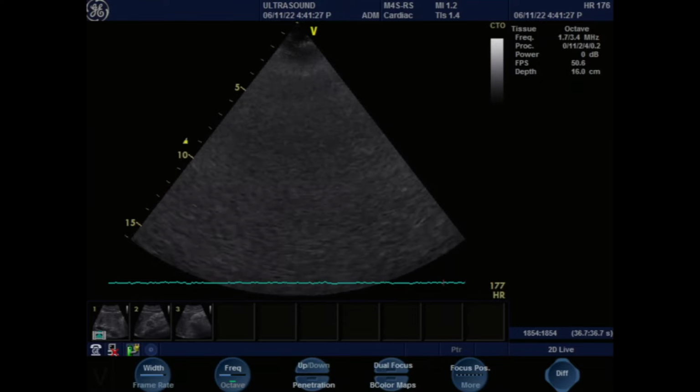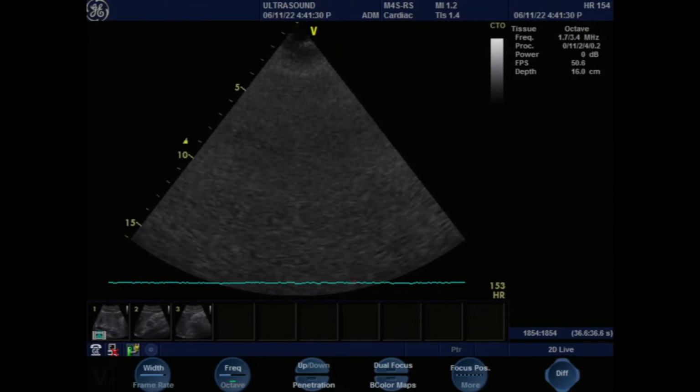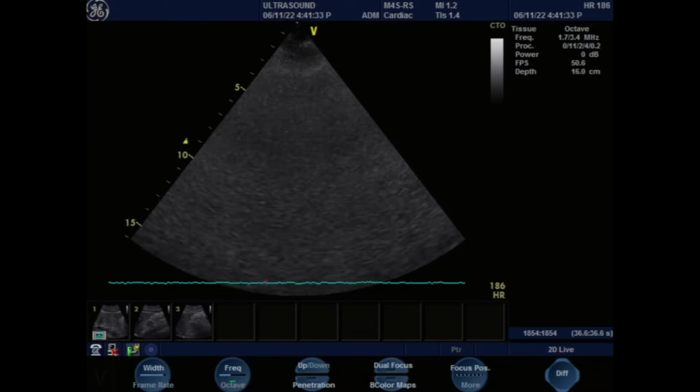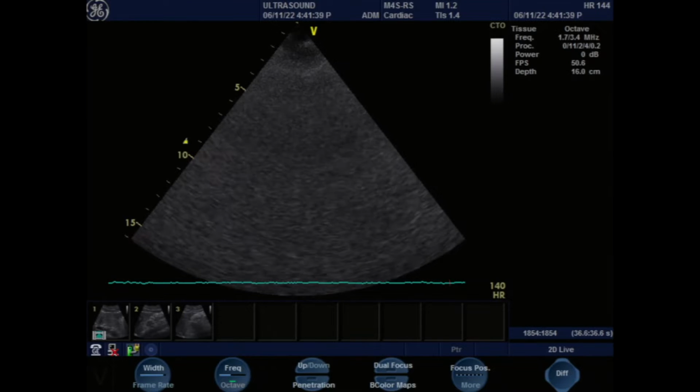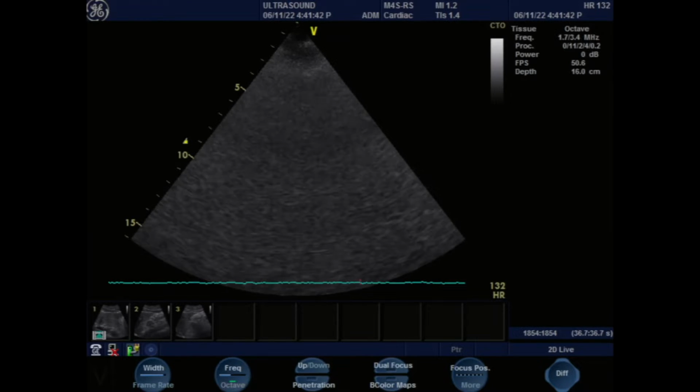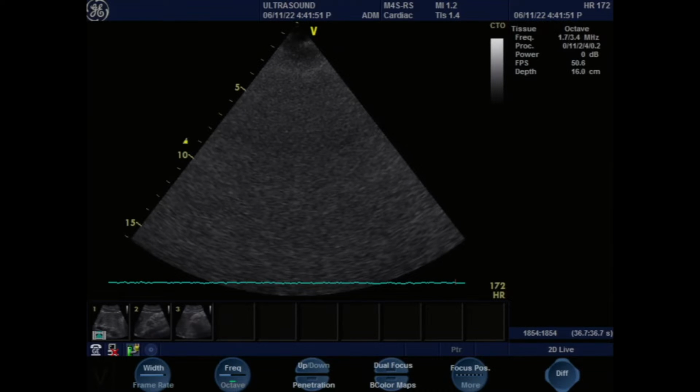A couple of things for our general audience: we want to get an idea of the ejection fraction of the patient. It's one of the key questions always asked for an echocardiogram. Well, we can always check to see if the patient is alive or not; if the patient is not alive, there's not going to be much to see. The other thing is the valves. We're looking at the left-sided valves, mostly the aortic valve and the mitral valve, and the tricuspid. Any echo is usually about 100 images, so there are a lot of things to look for.